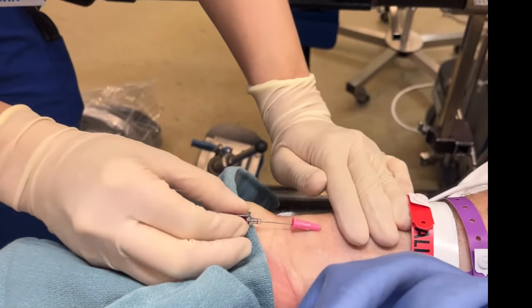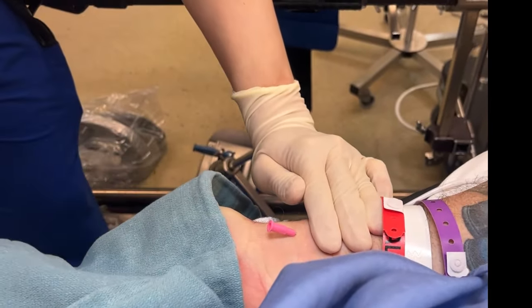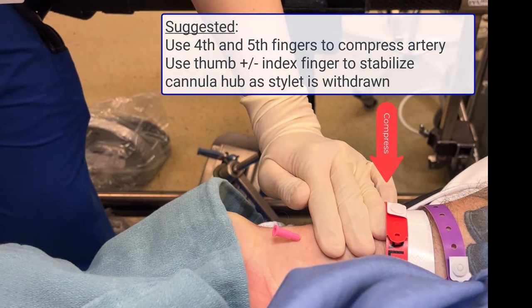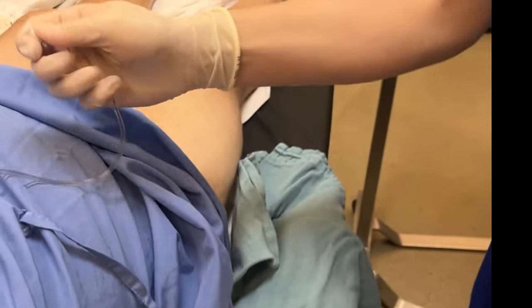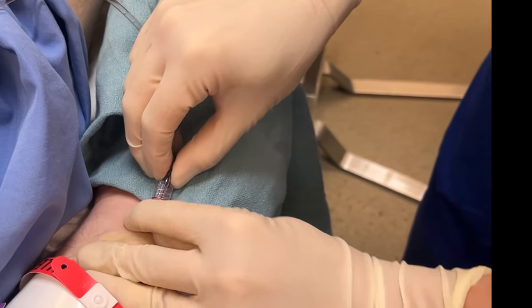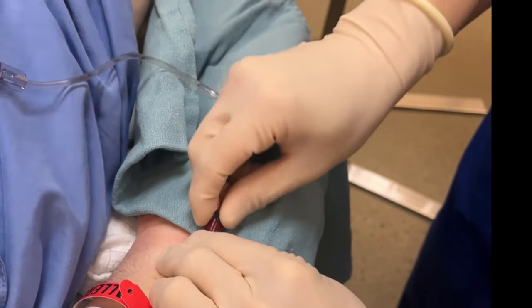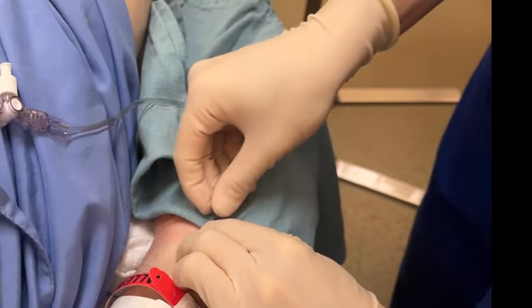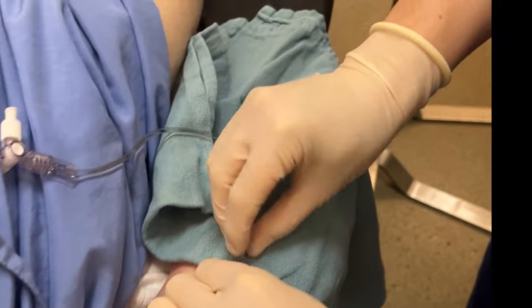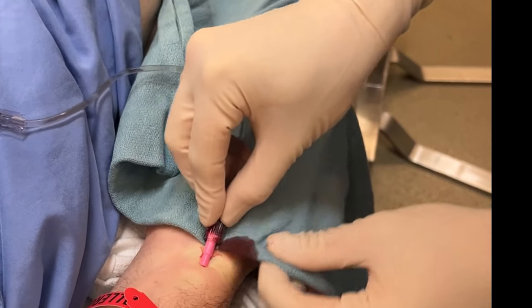Compress the artery proximal to the tip of the cannula as you withdraw the stylet. I prefer to compress with the fourth and fifth fingers of my left hand, and then use my thumb and index finger to hold the cannula hub in place as the stylet comes out. Reach for the arterial line tubing, flick off the end cap, and insert the end firmly into the cannula hub. This stops most of the backflow. Twist the tubing onto it to secure the connection.